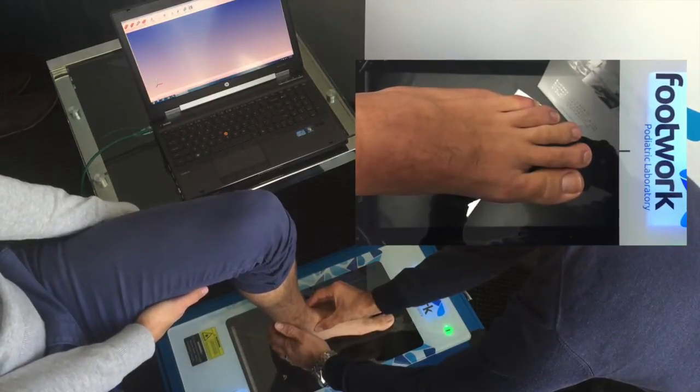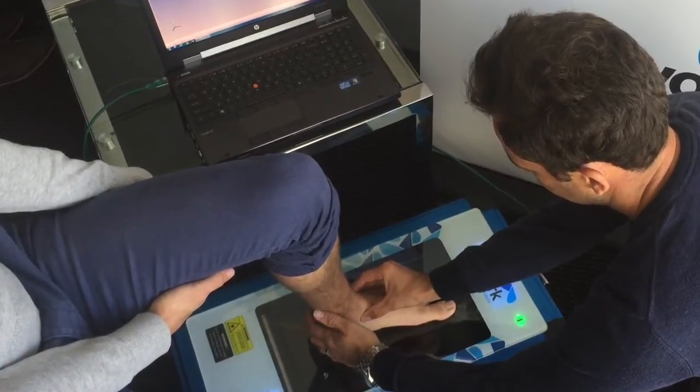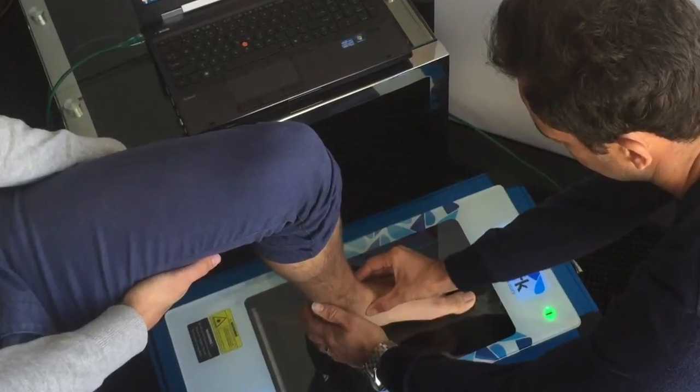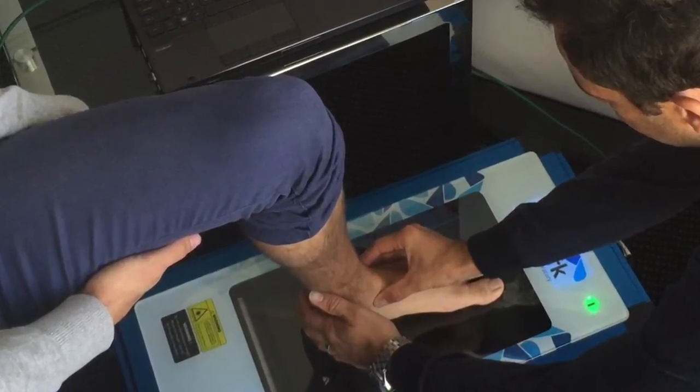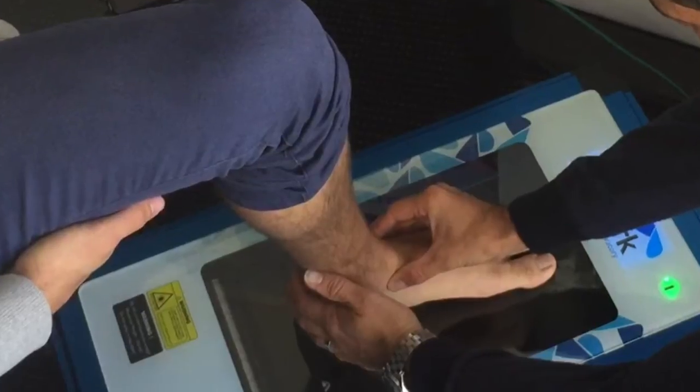Ensure the foot is approximately neutral and hover the foot over the glass. While doing this, avoid touching the glass as this will compress the skin and reduce the depth of the scan.